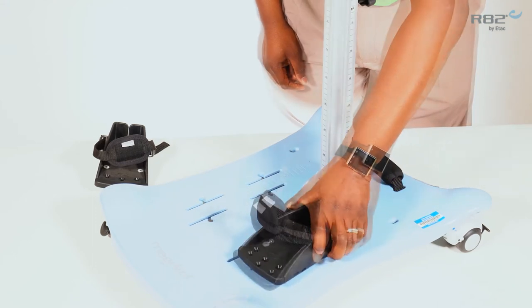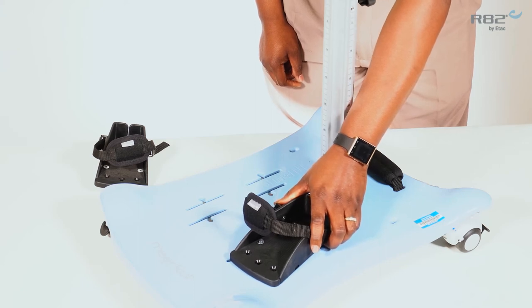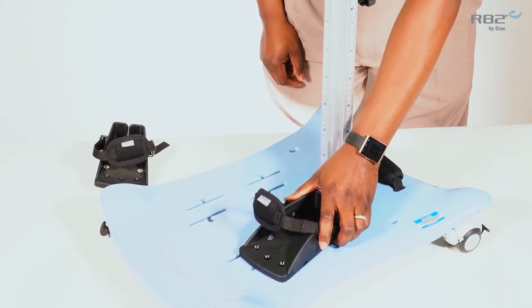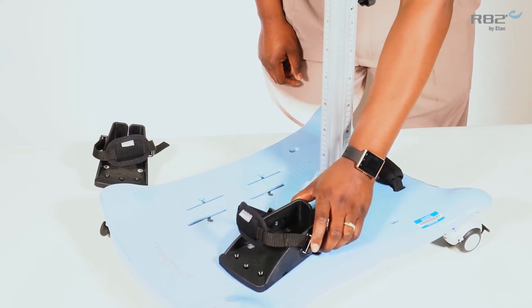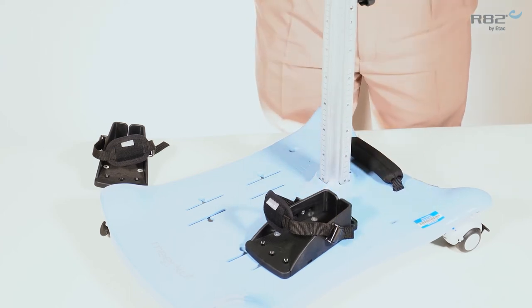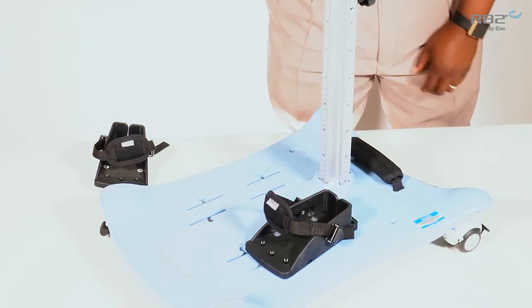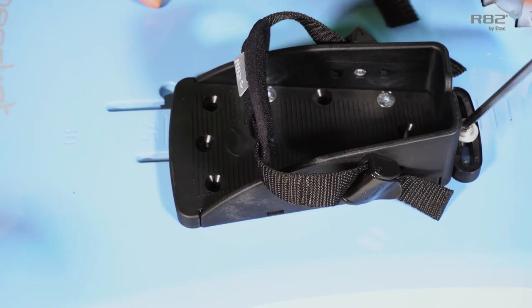Once you have aligned the bolts with the insertion point, slide the sandals over into the track. This will allow you forward and aft adjustment. Once you reach your desired adjustment, use the 5 mm tool to tighten the rear bolt of your sandal.